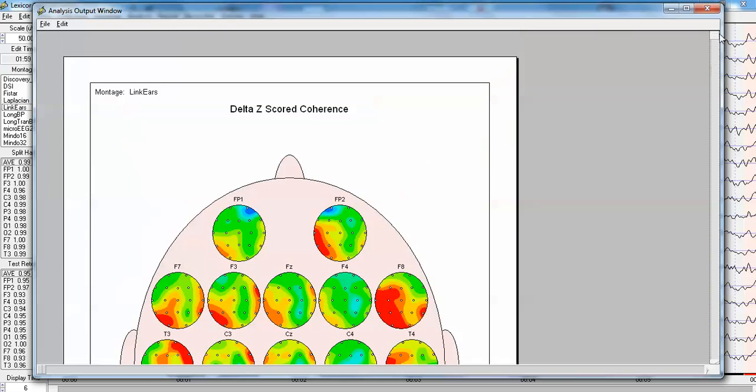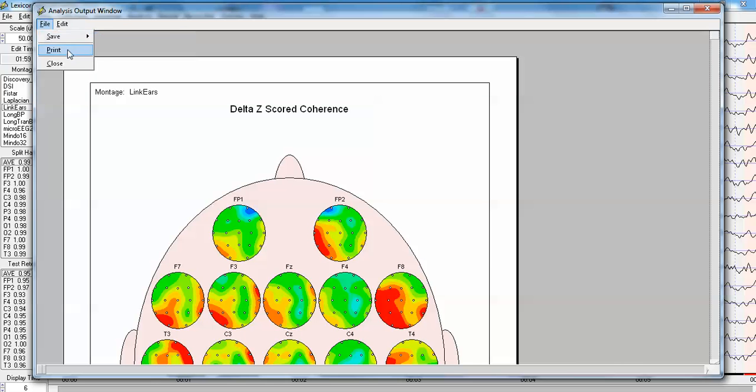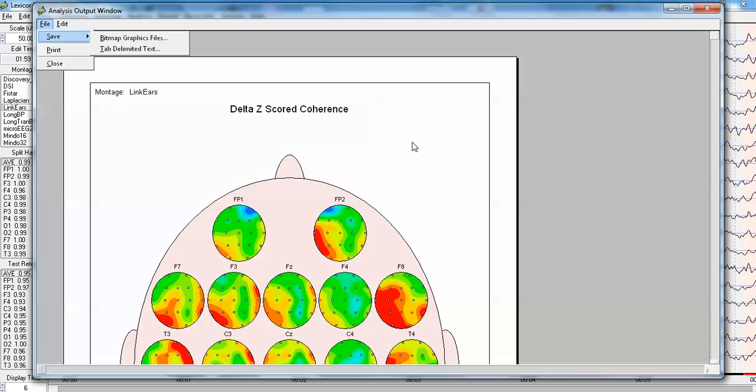And one, at this point, can save these data by clicking File, Save as Bitmaps, and create a subfolder. Or one can also save the tab delimited data, so all of the numbers, both the raw and the Z scores, are available to be imported into statistical programs.